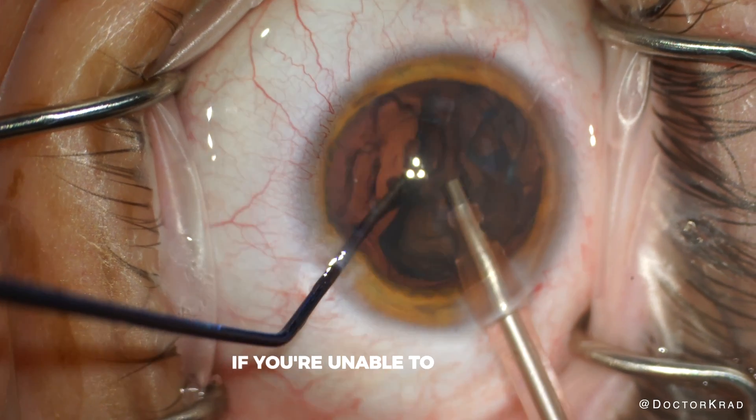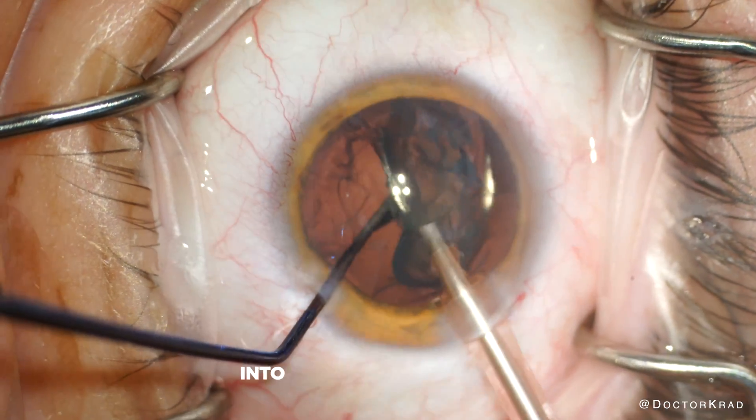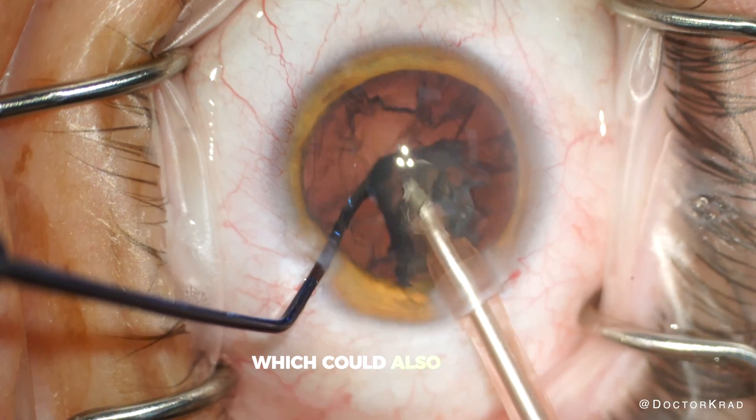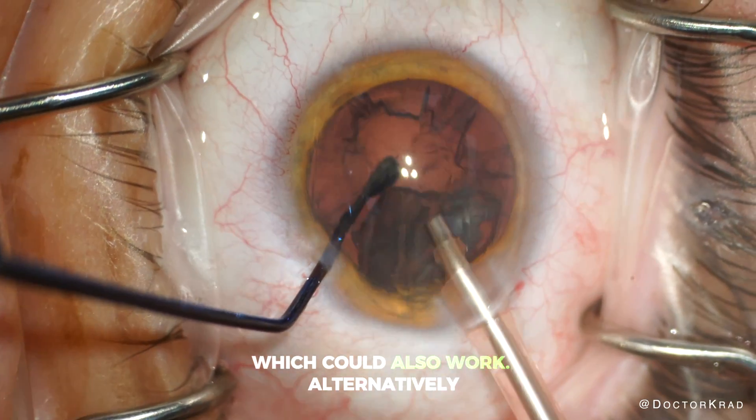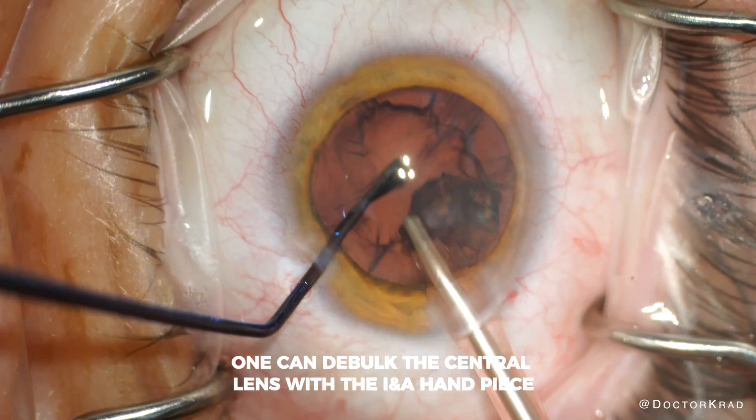If you're unable to fold the lens, you would need to prolapse the entire lens into the anterior chamber, which could also work. Alternatively, one can debulk the central lens with the I&A handpiece from the very start.